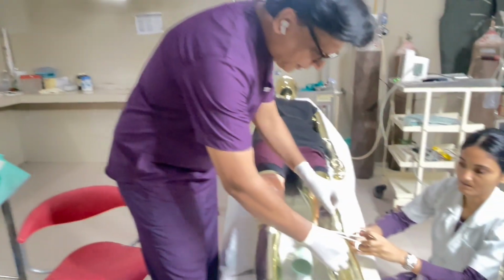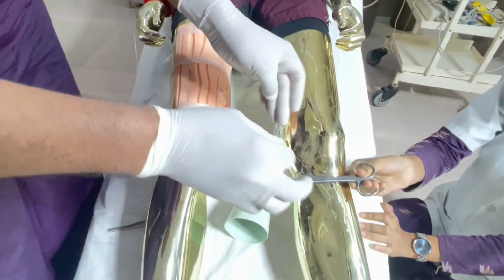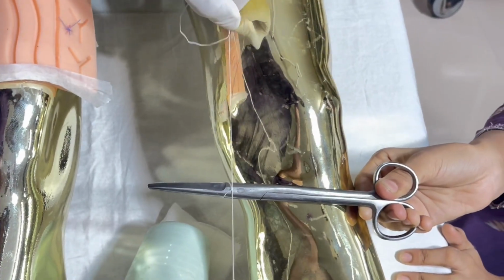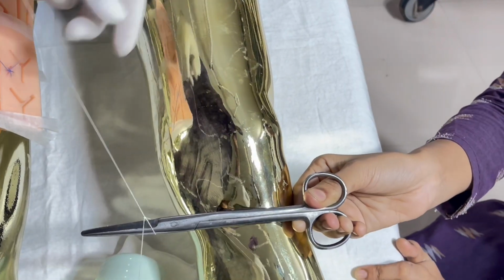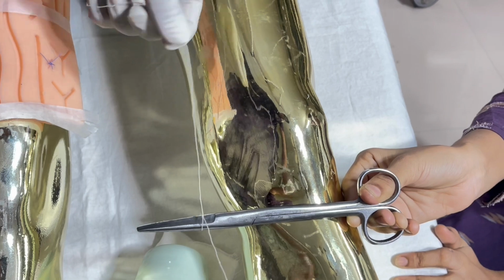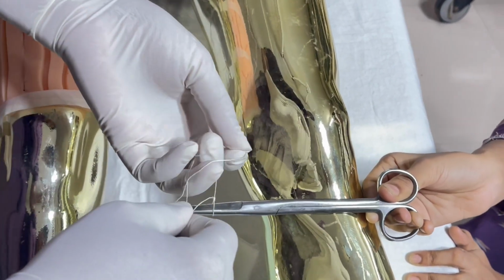And then there can be one more station, just to ligate, one hand tie. So suppose I am suturing around this, so this is one hand tie with the left hand, or there can be a tie with the finger or with the right hand. This is left hand.